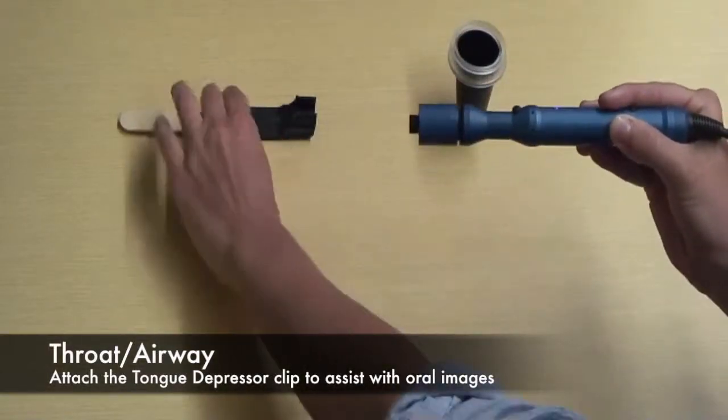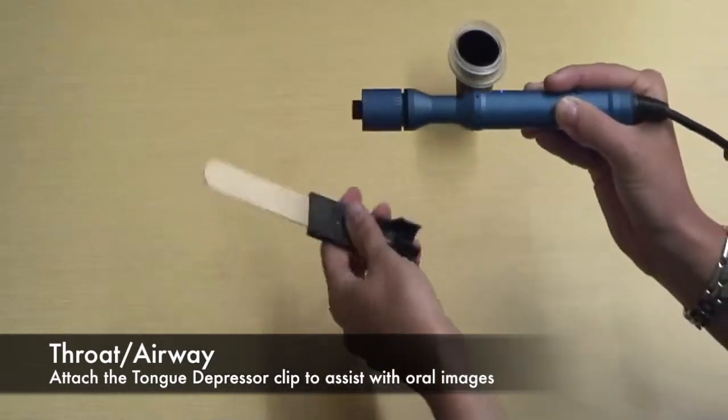Clip the tongue depressor attachment to the neck of the camera to assist in viewing the airway.